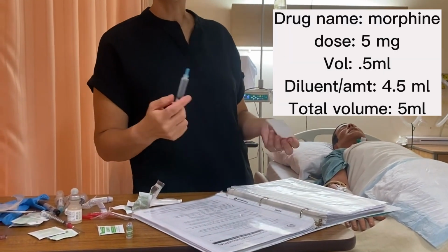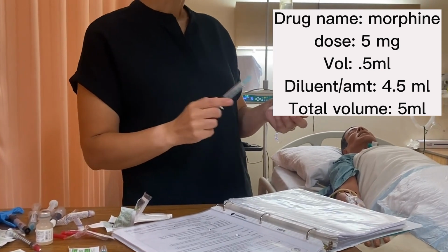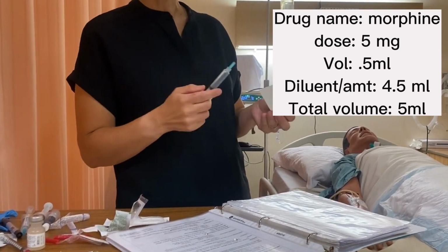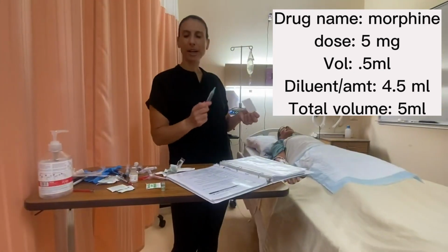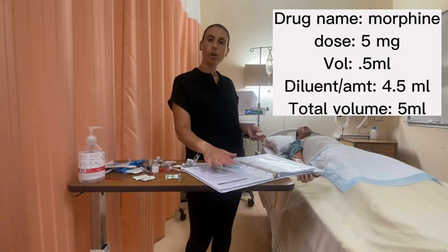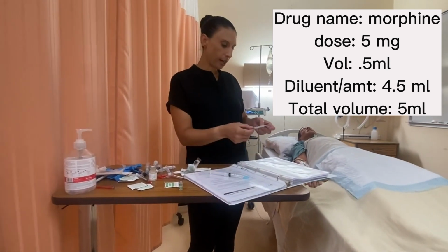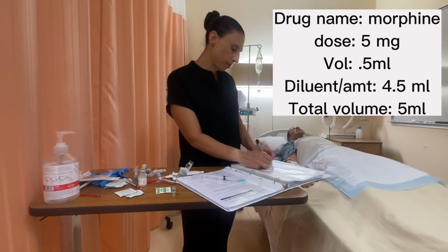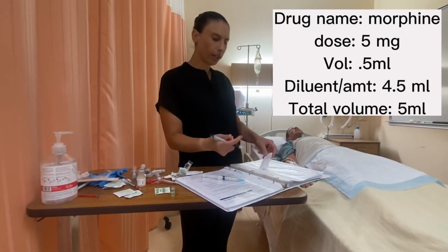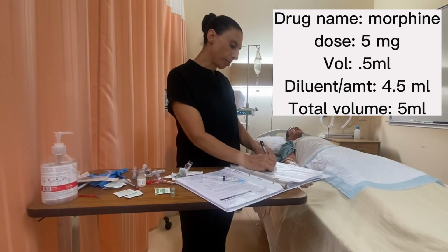My diluent, I chose 4.5 mLs of sterile water as my diluent. Concentration per mL, you don't really need to figure out. You could if you wanted to, but just like our mini bag, as long as we followed our PDM, we know that we have mixed this safely, so it's not too concentrated. So I can just put my total volume is 5 mLs. And then, of course, date and time, maybe put your patient's initials, maybe their room number.